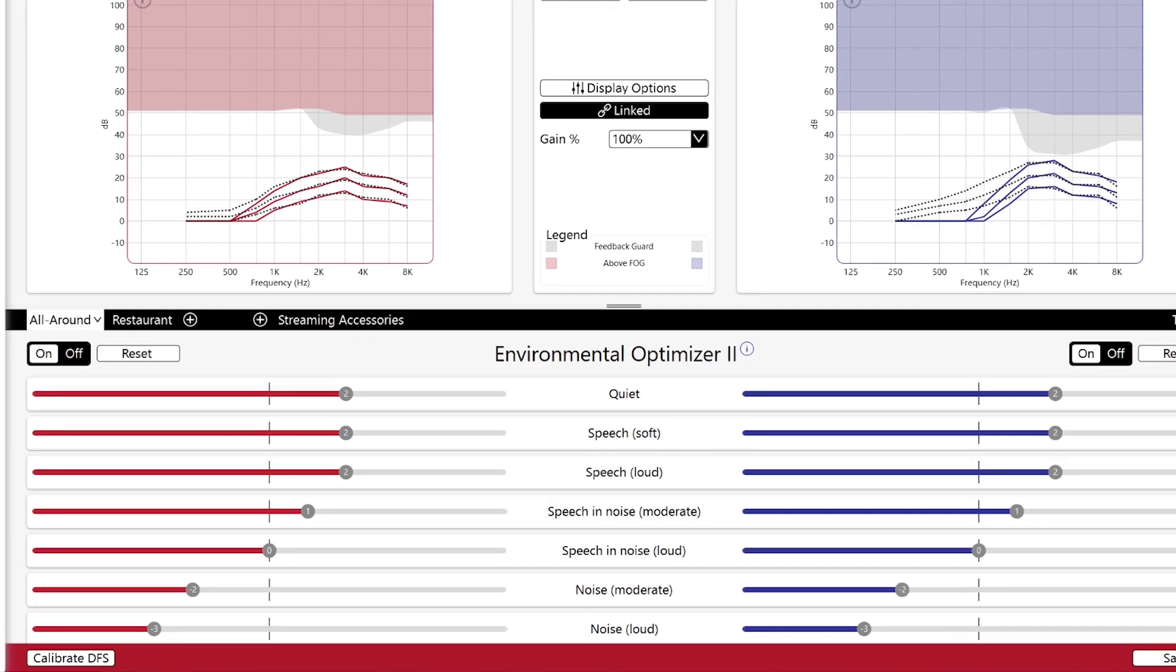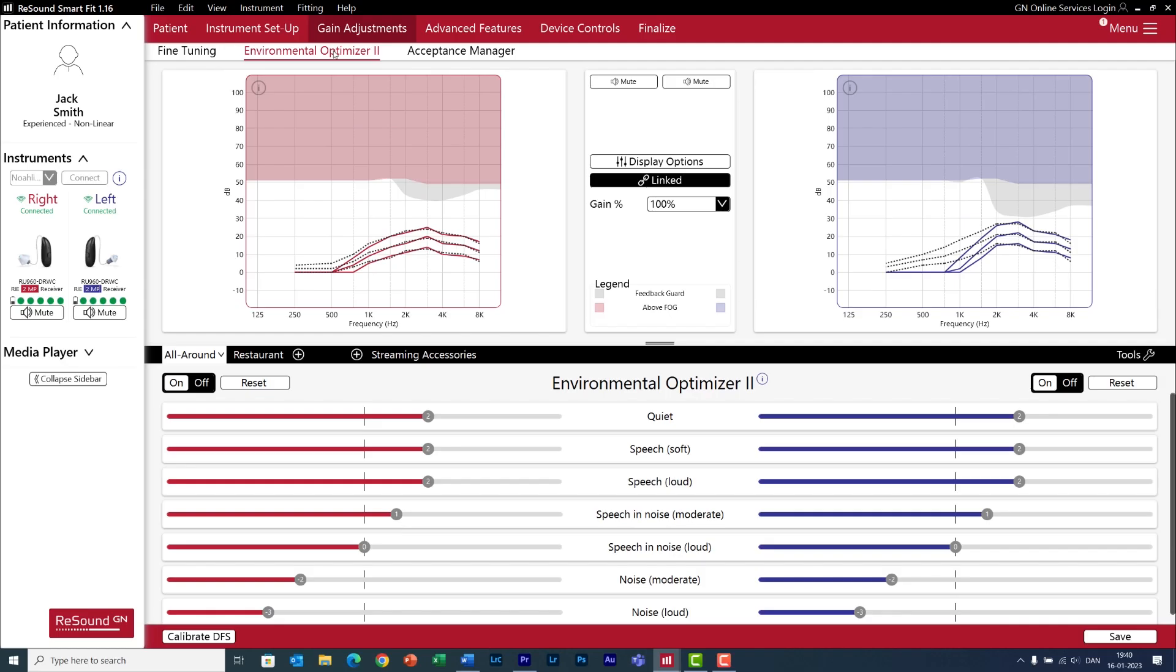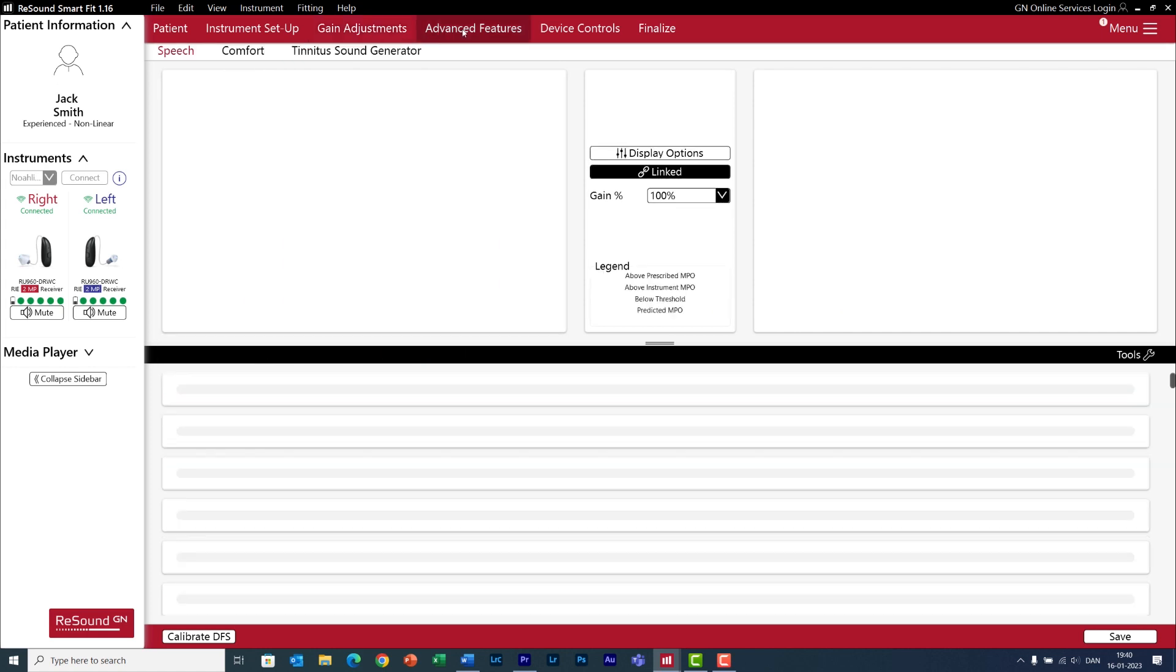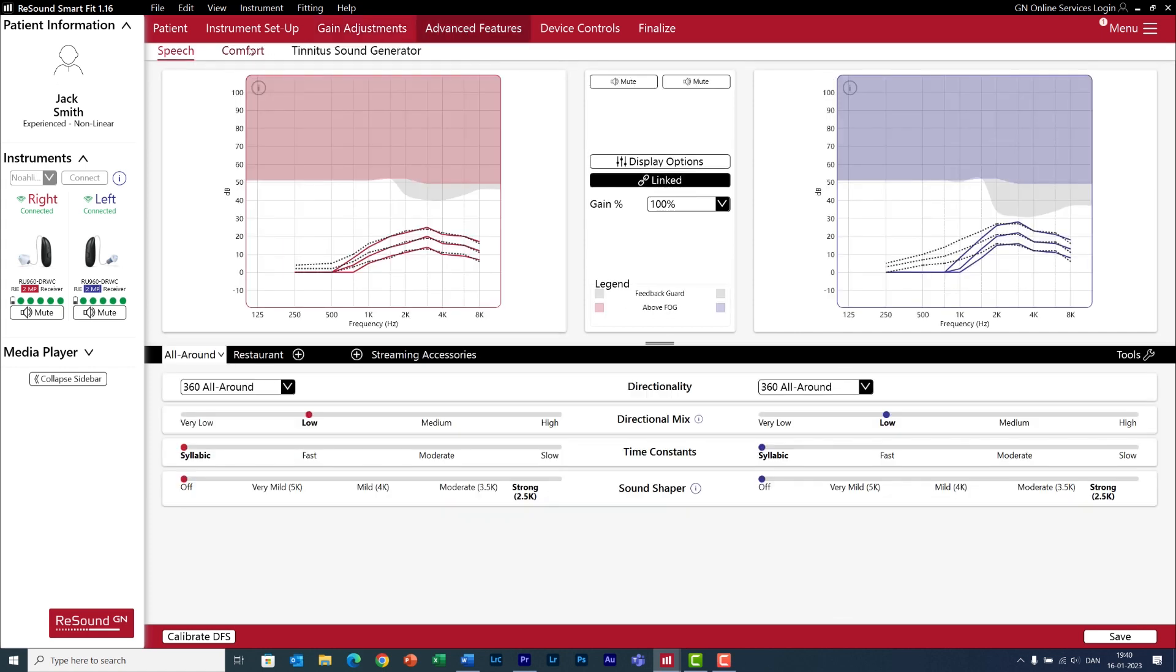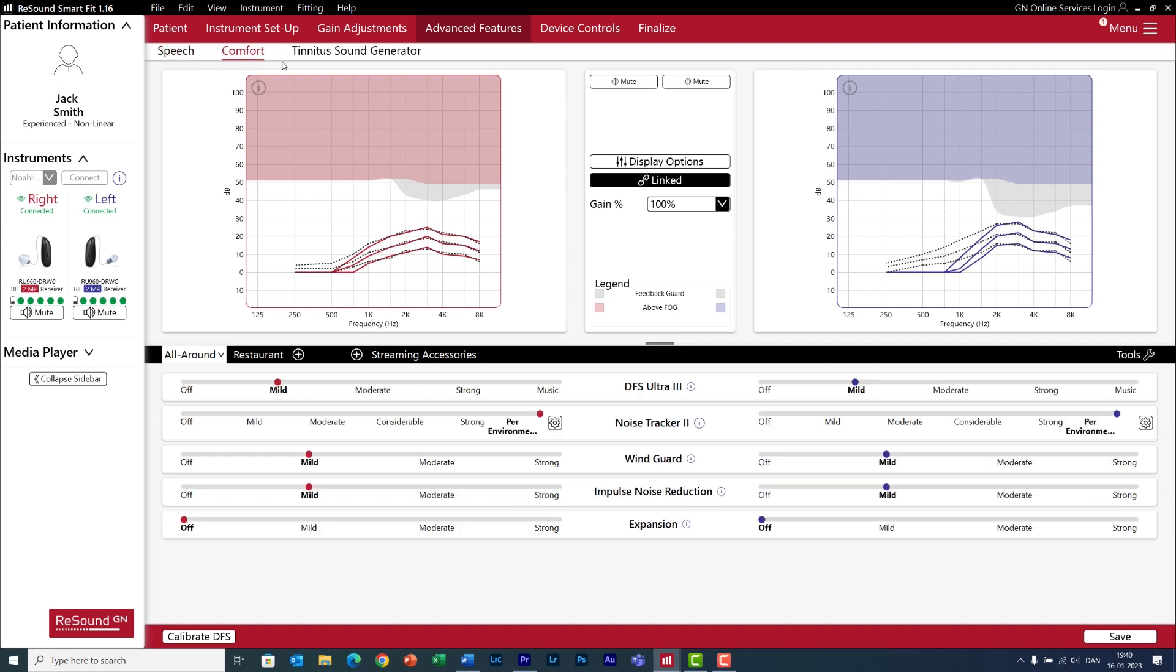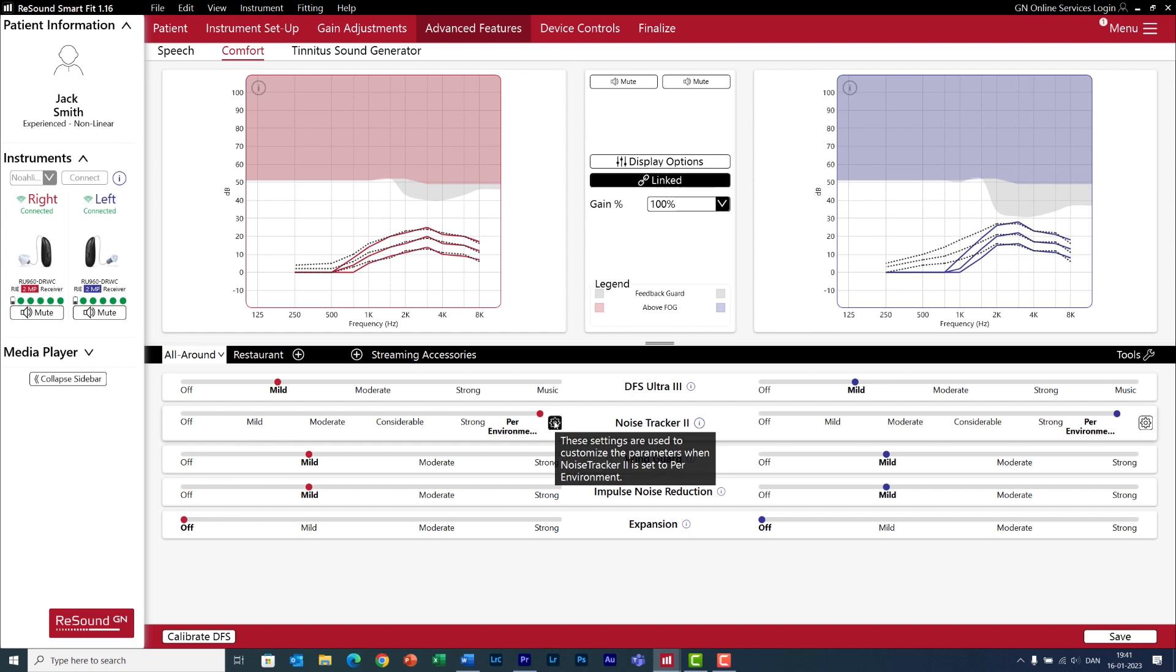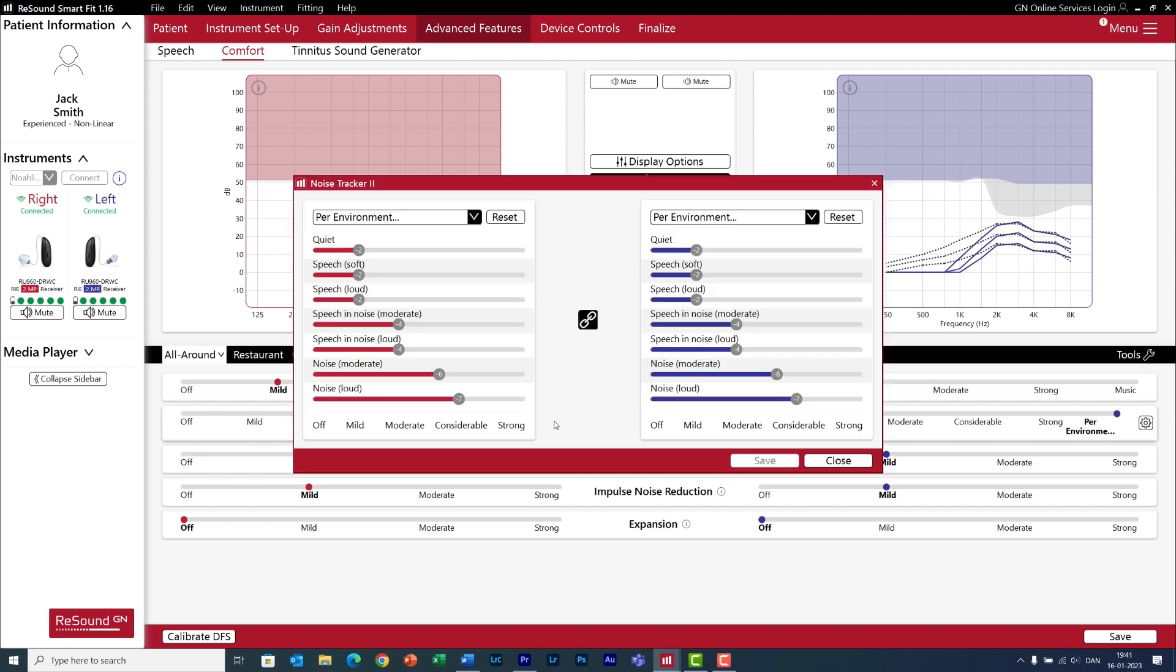The Environmental Optimizer is an automatic volume control that you can program in up to seven environments, from quiet to very noisy situations. Also, for speech and noise in places with moderate, or loud noise. And it gets better because in price point nine, you can also program how much noise reduction you want for each of these environments. So, go to advanced features, select comfort, noise tracker, which is the name for the noise reduction algorithm.